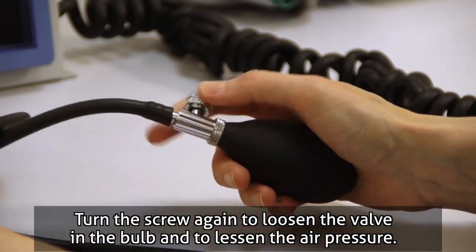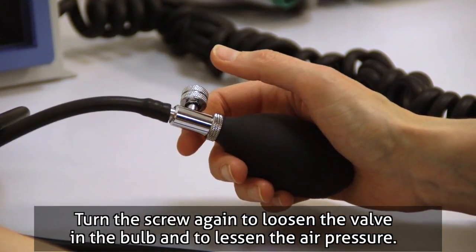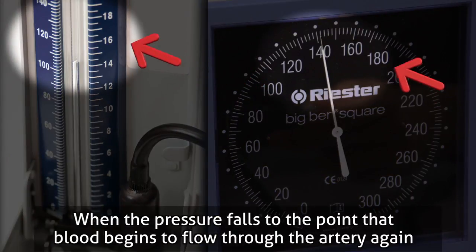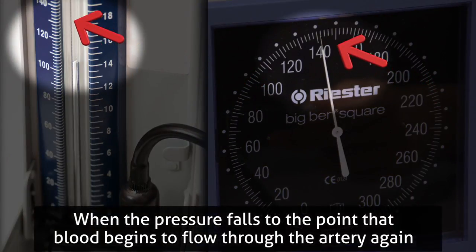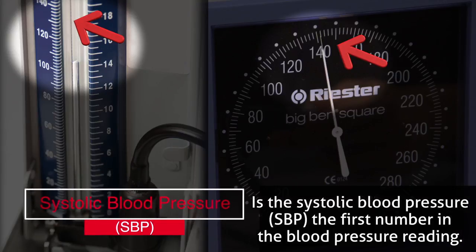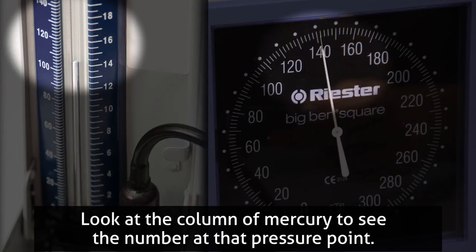Turn the screw again to loosen the valve in the bulb and to lessen the air pressure. Pressure is then decreased so that the rate of drop is 2 millimetres per second. When the pressure falls to the point that blood begins to flow through the artery again, the number that the column of mercury has risen to at the first sound heard in the stethoscope is the systolic blood pressure (SBP) — the first number in the blood pressure reading. Look at the column of mercury to see the number at that pressure point.